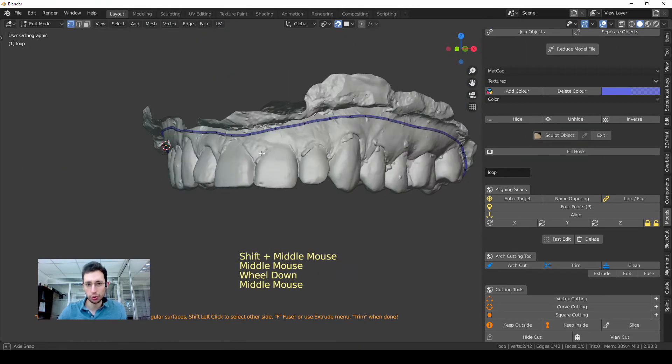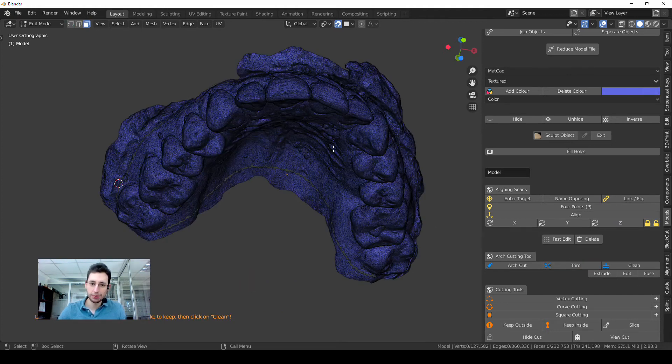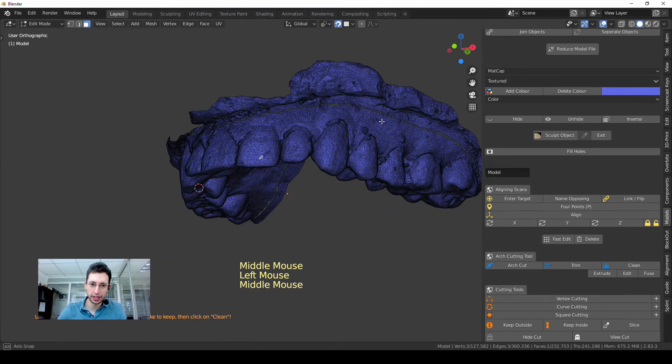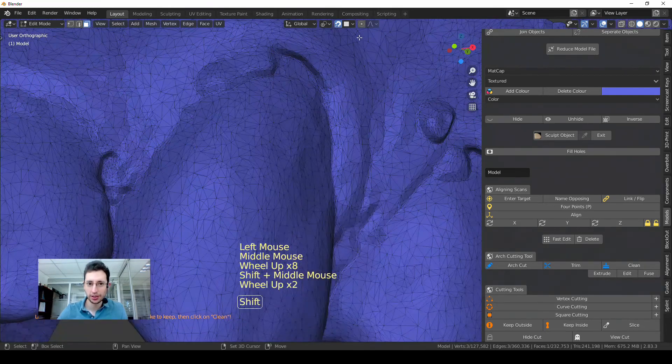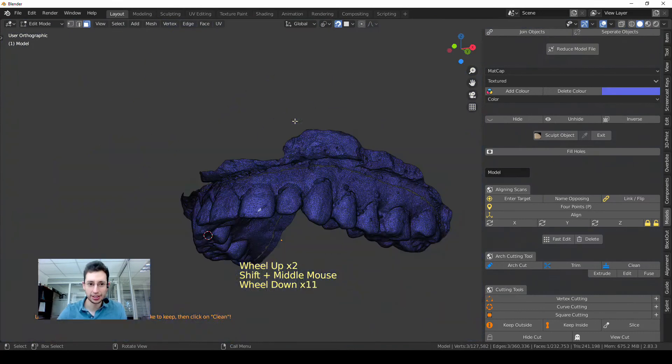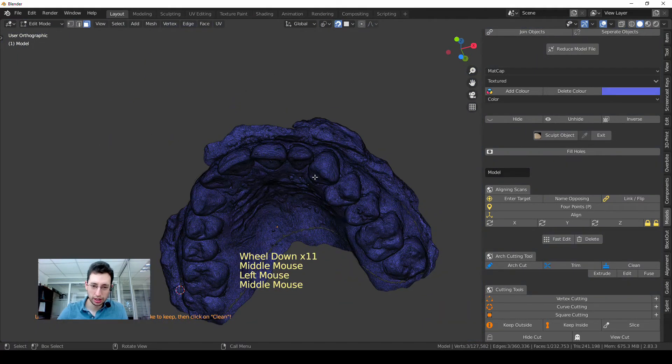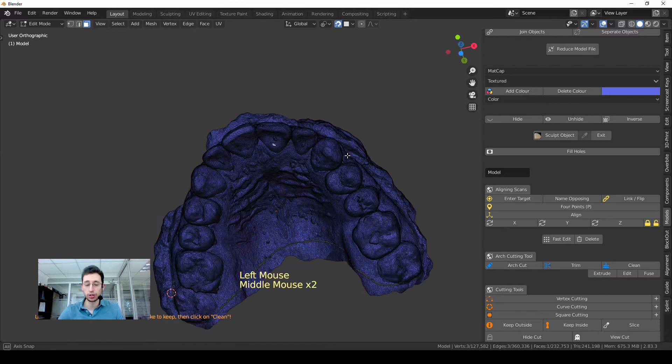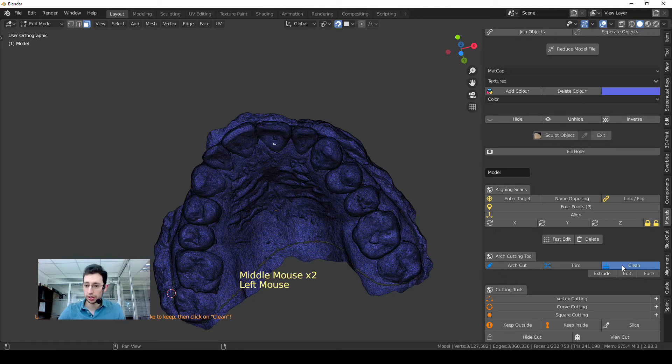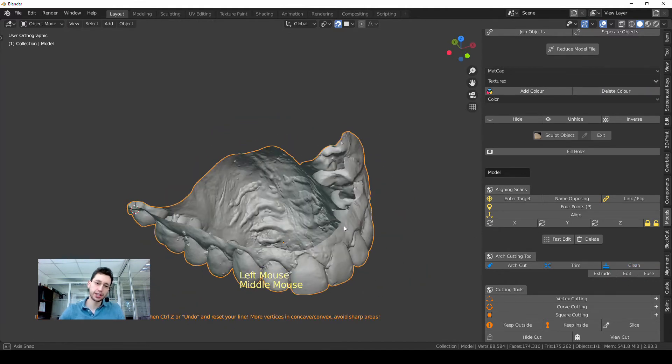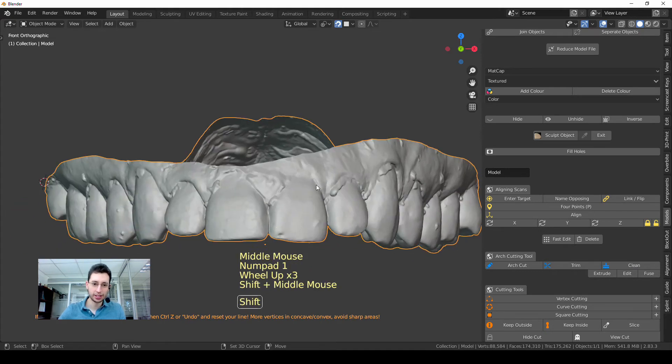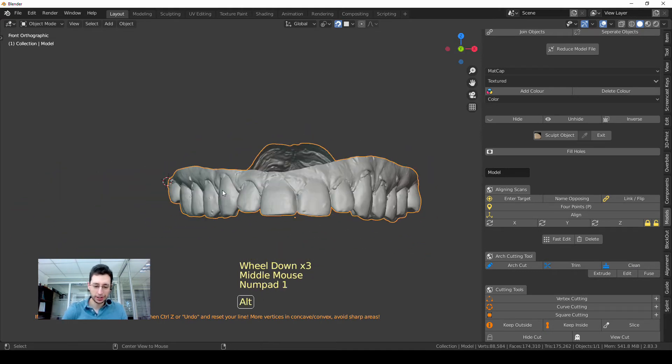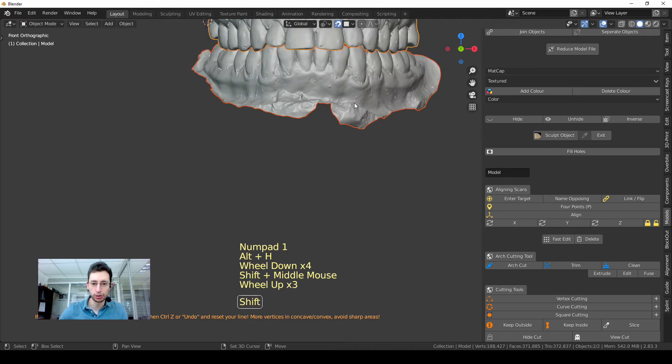So once I have everything in place, I use this key Trim and both parts are now separate, as you can see, like this. It is separate. I choose any vertex on the part I want to preserve and then Clean, and everything else is erased, is deleted.